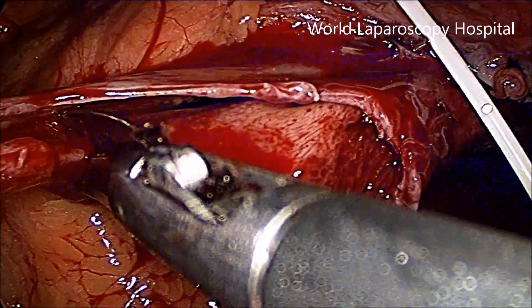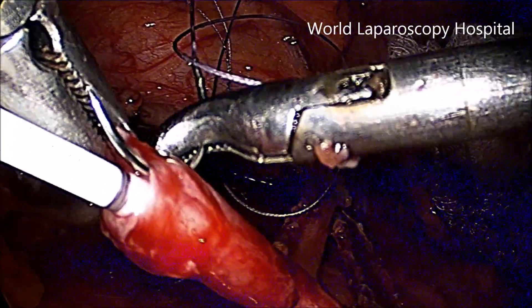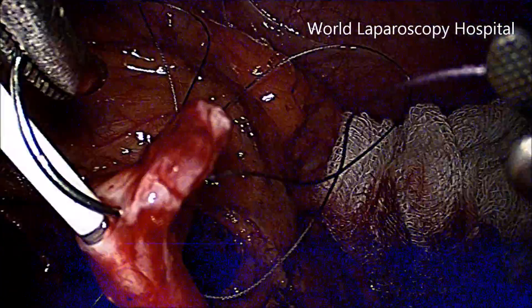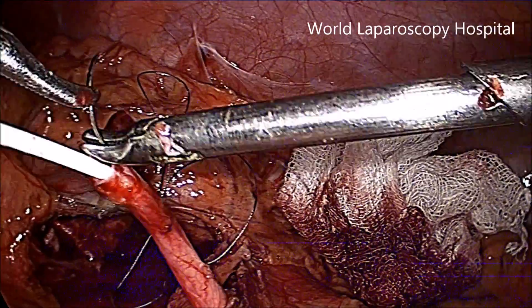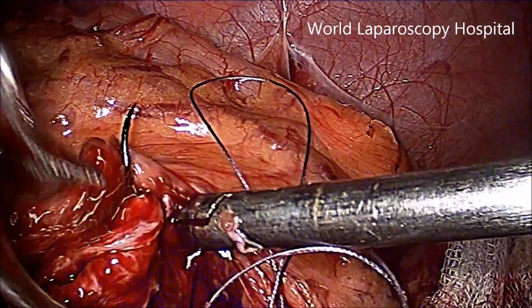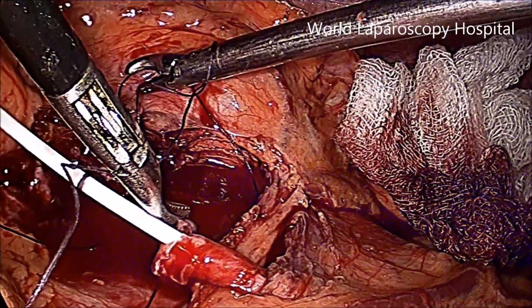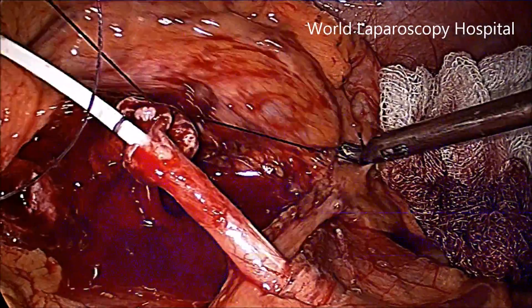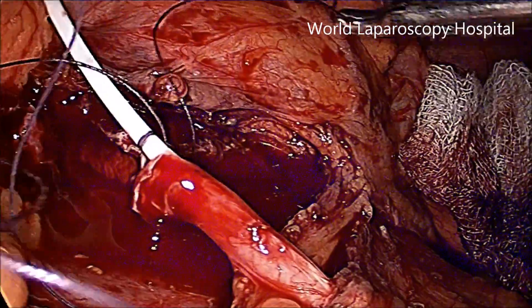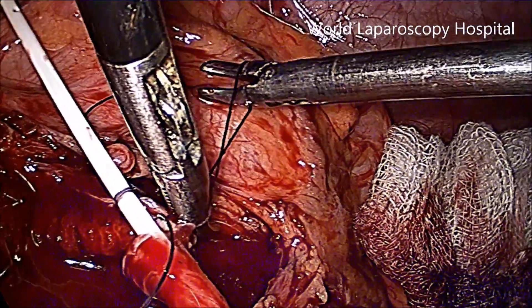A little flap is still attached and now the anastomosis has started; the posterior layer is sutured first. The surgeon's knot is the ideal knot for pyeloplasty, so that continuous suturing is also possible.